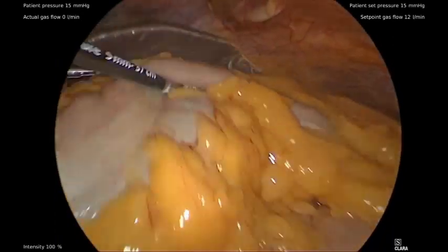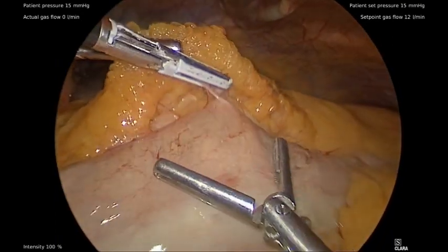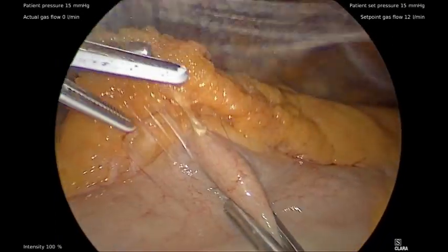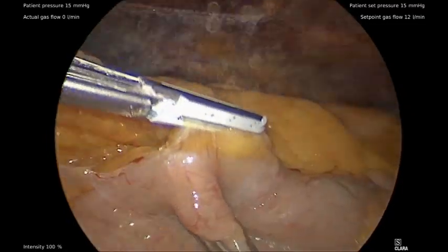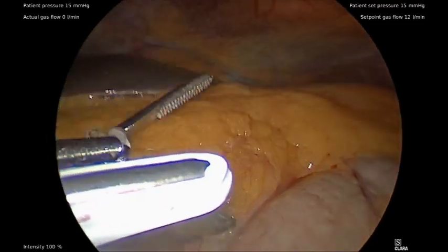The procedure began with the mobilization of the transverse colon off the greater omentum laterally towards the splenic flexure.